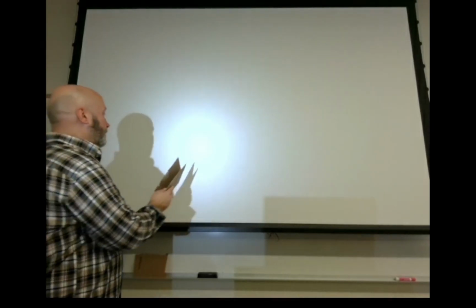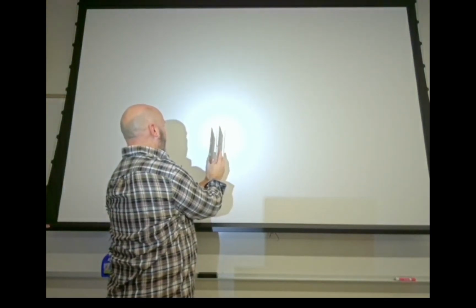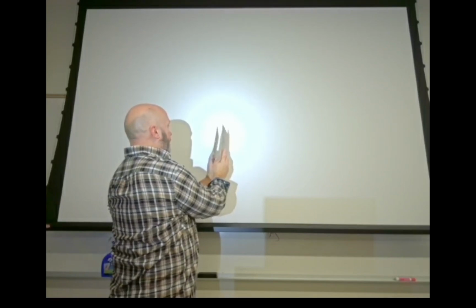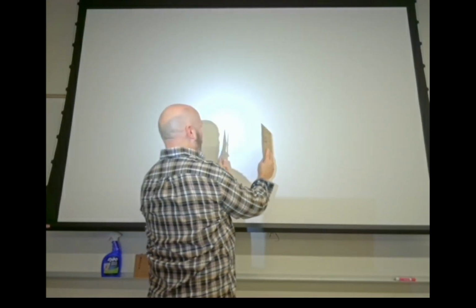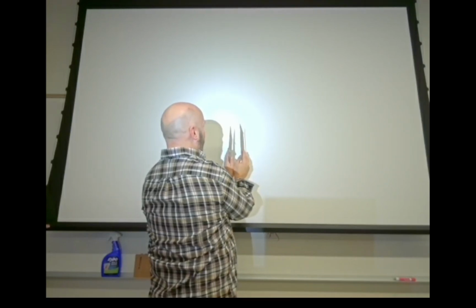So if you're in the center of your image receptor, the center of the grid, you're centered to the center of the grid, then you've got that parallel relationship, right? But let's say though you're not centered, all right? I tell you what, pass the flashlight, I'm gonna hold these still, stay focused where you are, but pass the flashlight to your right.